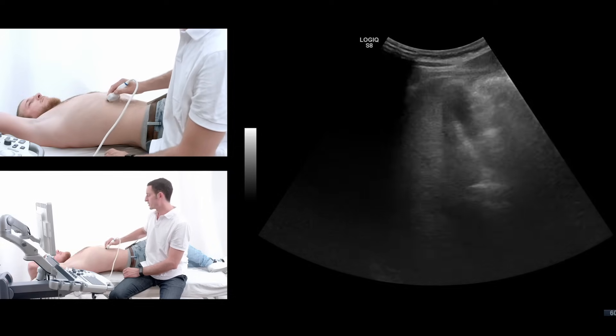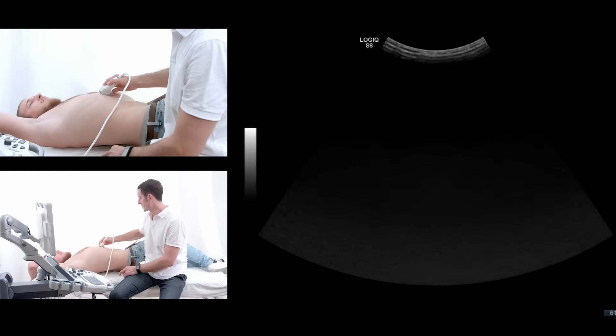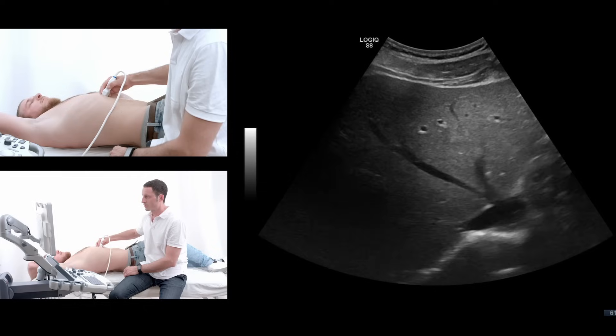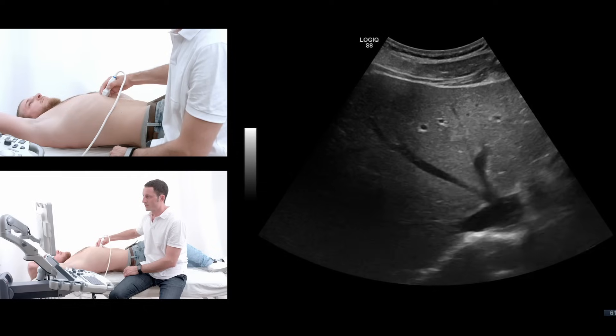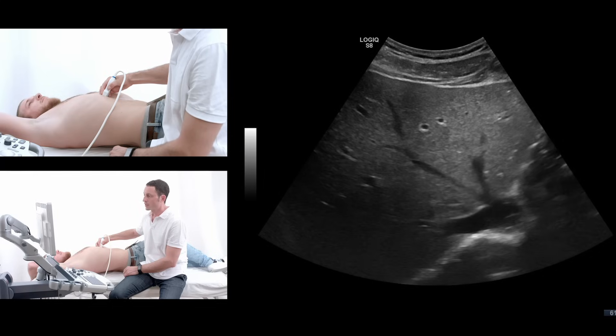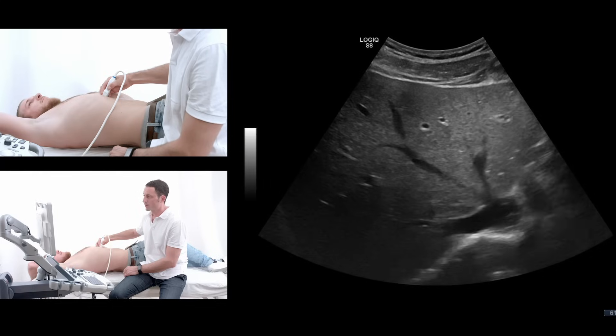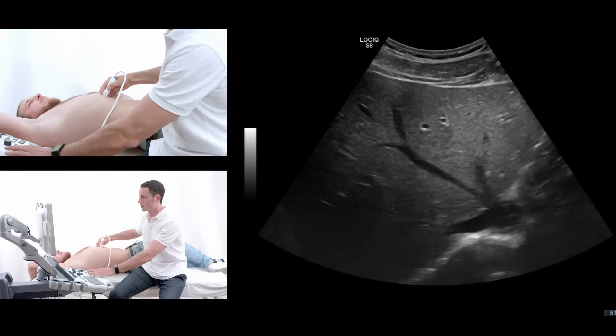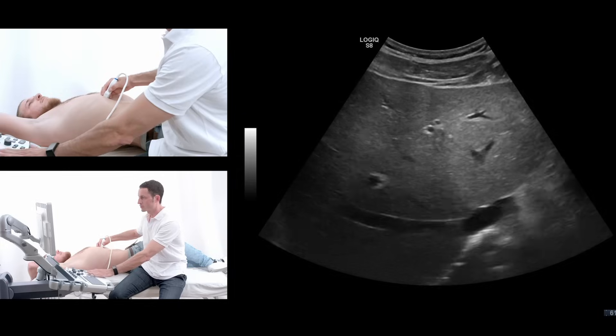When I've done that, I go into the standard cross sections of the center of the liver. The most cranial of them representing the liver vein star, as you can see here, joining in the inferior vena cava, as you can see, which would be this structure here.